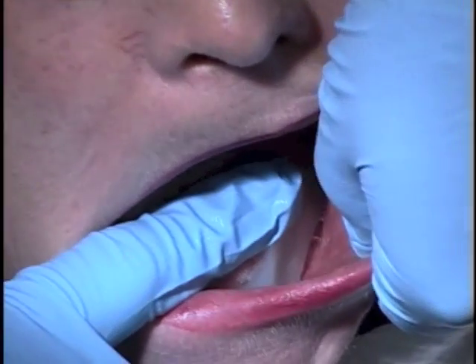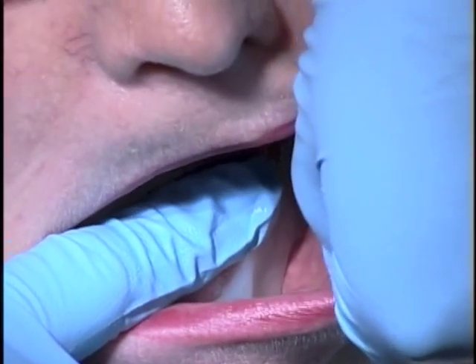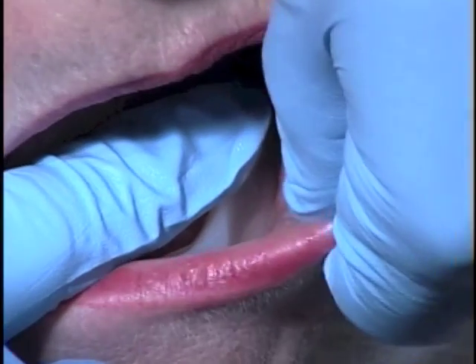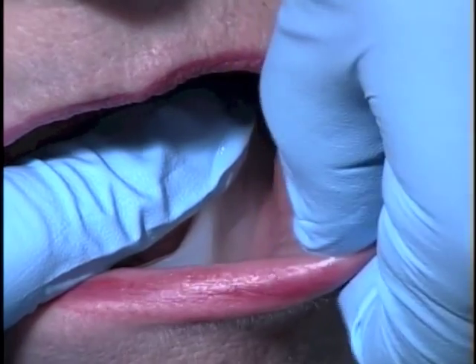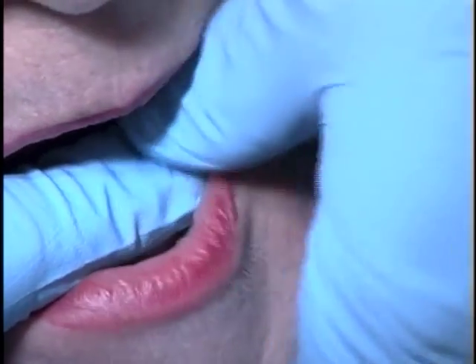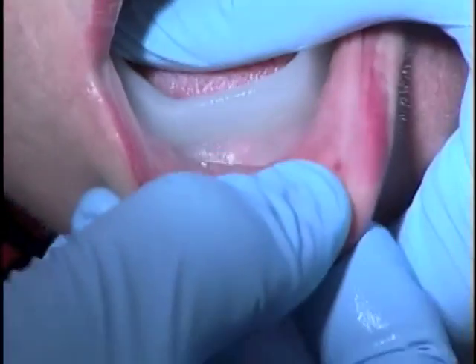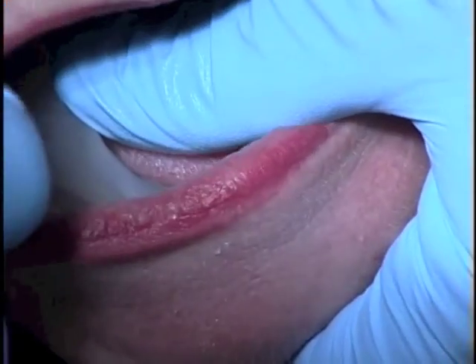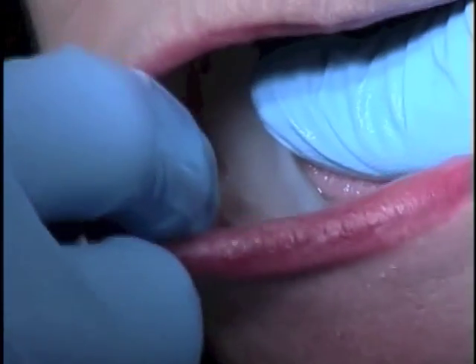and then we want to examine the peripheries and see if those peripheries are too long. And as we can see, when we move the tissues, the cheek, that those peripheries are touching the peripheral rolls, so therefore they need to be shortened. The same is true across the labial, in that it's a little long. As we can see, it interferes with the movement of it. And the same is true of the right side.